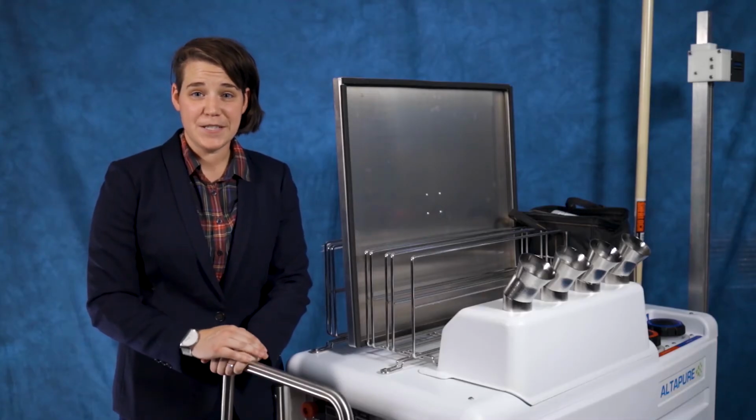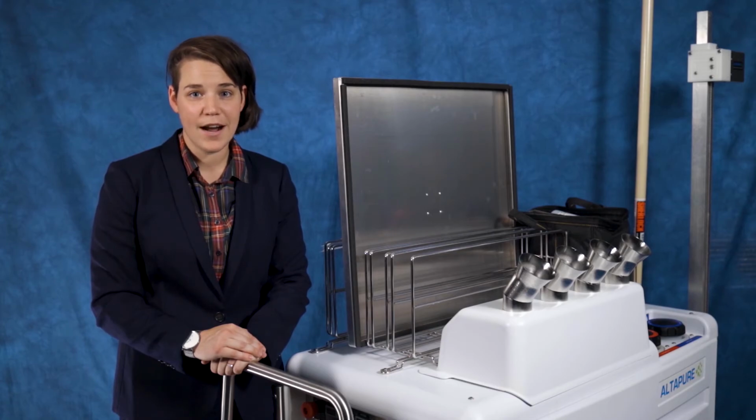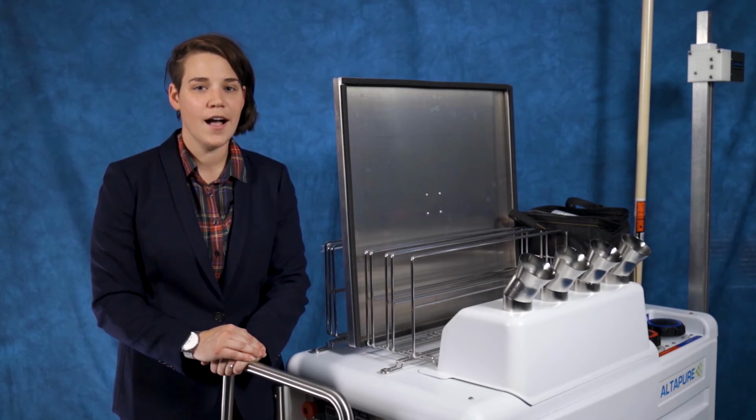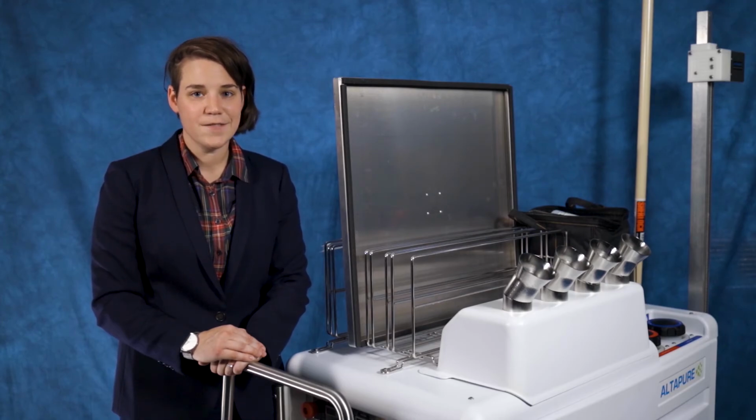While the Altapure system could be used after every discharge and between all cases in the OR, a targeted approach is much more practical and time-friendly. Most facilities utilize the Altapure system after a terminal discharge, isolation discharge, any room in which a patient had an MDRO, or multi-drug resistant organism, and an end-of-day OR procedure. Ultimately, it's up to the facility to decide when the Altapure system will be utilized.